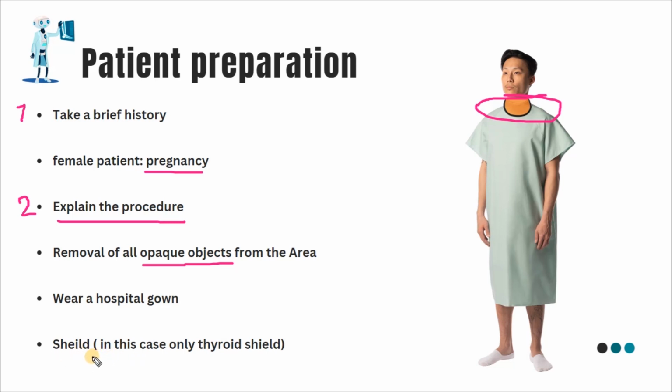So it highly depends on the clinical condition and the reason for the X-ray. But in case you have an acute case, a trauma case, for sure you need to include the sacrum and the coccyx because of the suspected fracture. So you cannot put a gonad shield for this kind of patient.